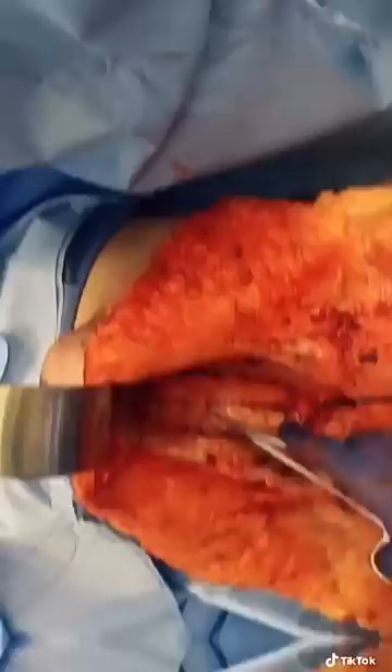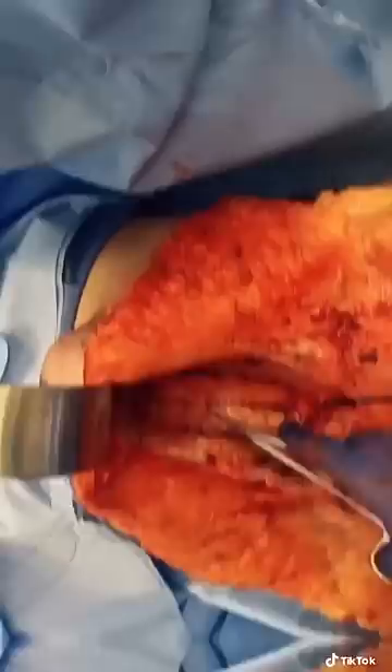Next I divide the skin flap up to the belly button, and then I tighten up her muscles using permanent sutures. You could bounce a quarter off the inside of that tummy.